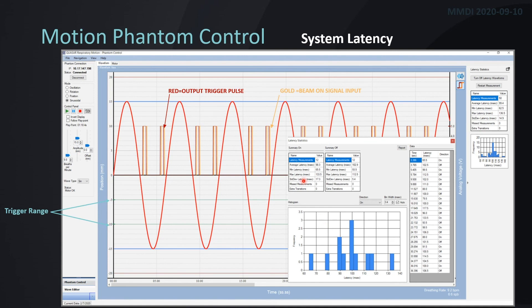All information gathered from the latency process can be exported, so if you're using another software application to dive deeper into the data, you definitely can. It is a very useful tool, and if you're interested in system latency, contact MODIS for a more detailed rundown of the process.